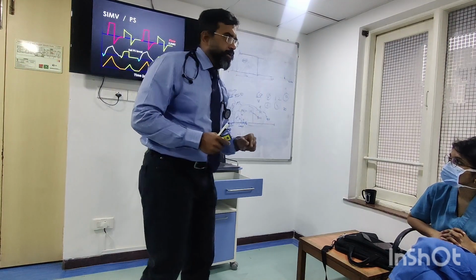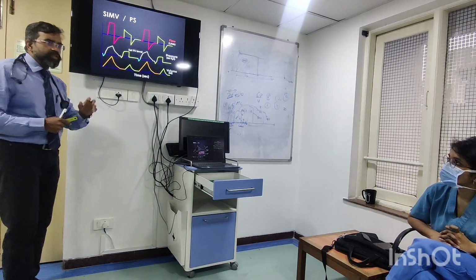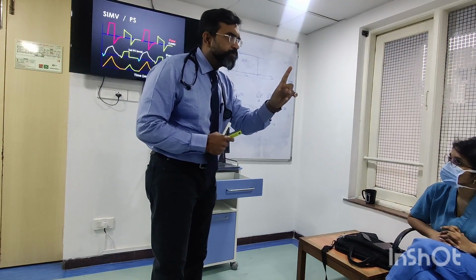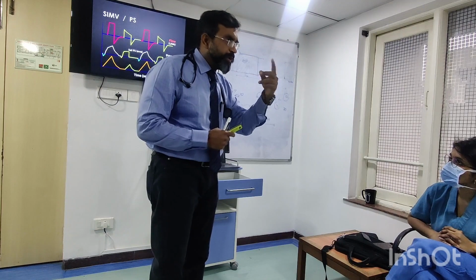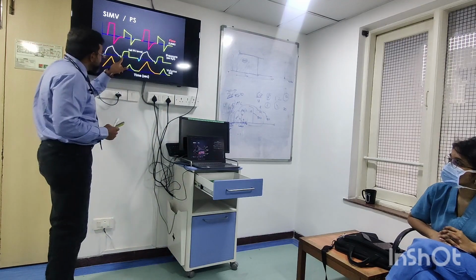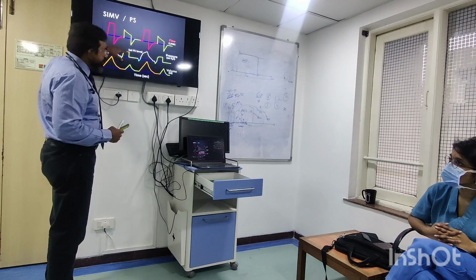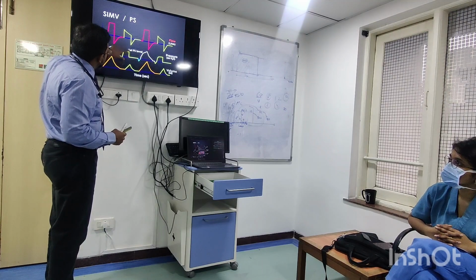What is your cycling? What is the cycling? Conversion from inspiratory phase to expiratory phase, that means allowing the patient to breathe, converting from inspiration to expiration. So let us see. This inspiration is going on, this expiration is going on, but this is at a set pressure. Can time be the cycle here? Time is less likely.